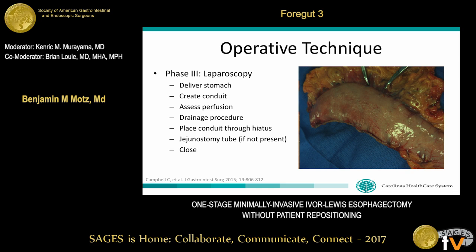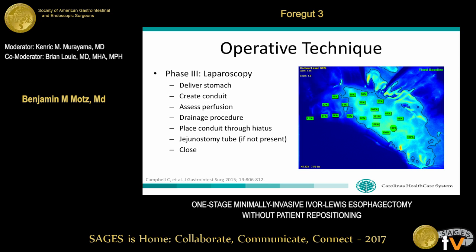We use the greater curve, placing retraction at the fundus of the stomach to elongate it and achieve a uniform conduit diameter, which also minimizes bunching at the staple line. We use either Doppler or indocyanine green fluorescence angiography to assess conduit perfusion. We've previously published that indocyanine green angiography significantly decreases anastomotic leak rates at our institution. We then perform a gastric drainage procedure — either pyloromyotomy or pyloroplasty — place the conduit through the hiatus into the chest, place a jejunostomy tube if not already present, and close the abdomen.